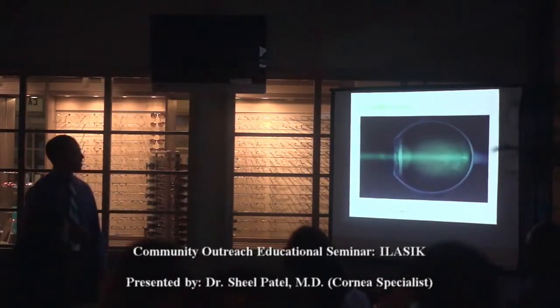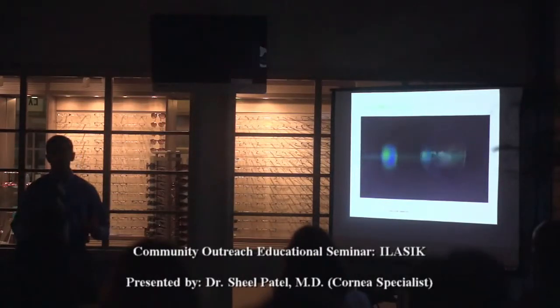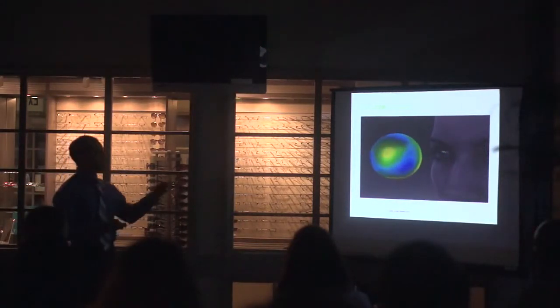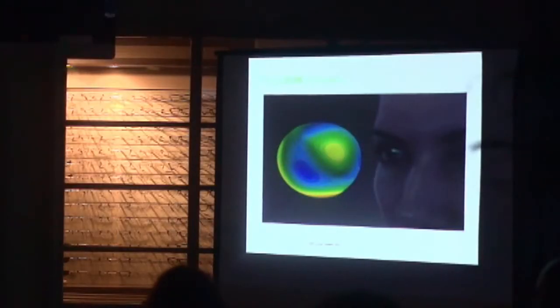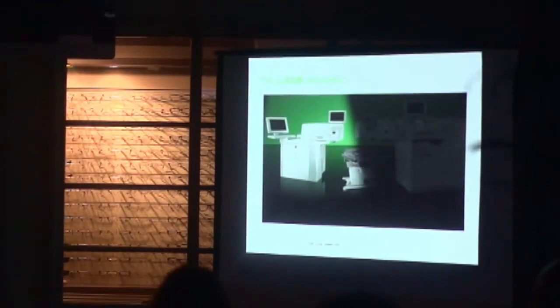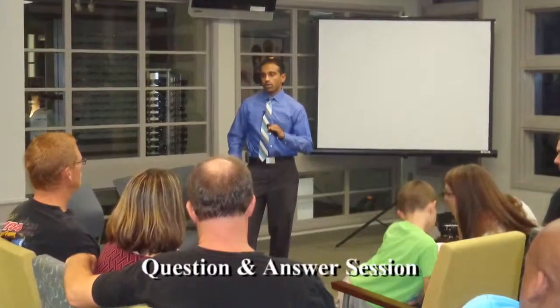So this is basically the wave scan, a picture of the visual imperfections of the eye. When light is reflected into the eye and bounces back, a machine called the wave scan helps capture that. This image right here is one unique set of measurements of an eye to show the different topography or shape of an eye so that the laser can treat it. This is the intralase, which will help create a flap, which in turn will allow the surgeon to perform the procedure afterwards.